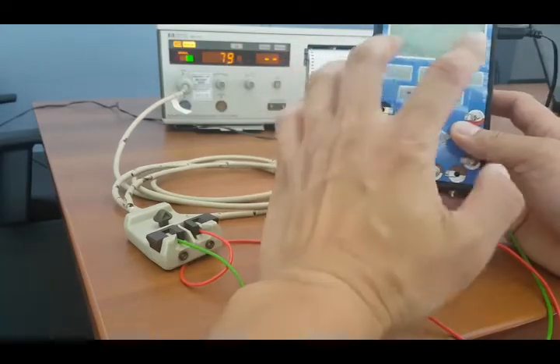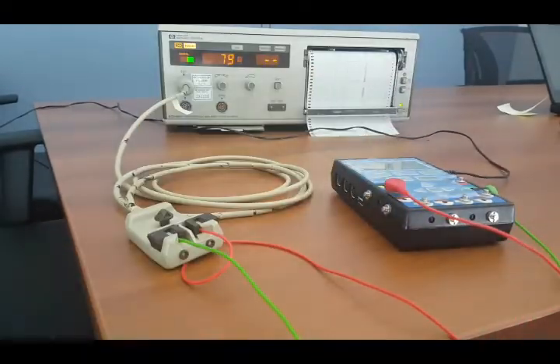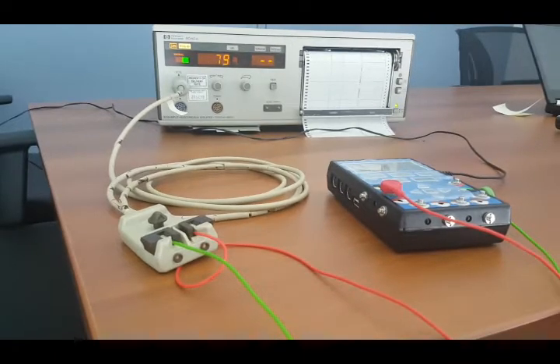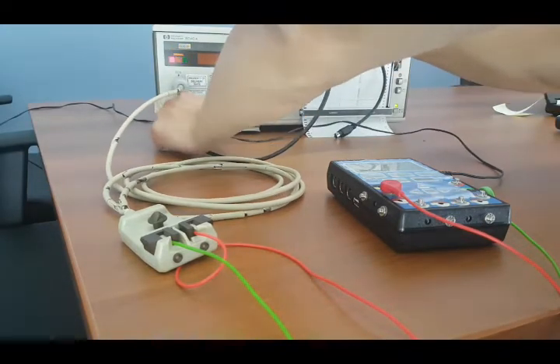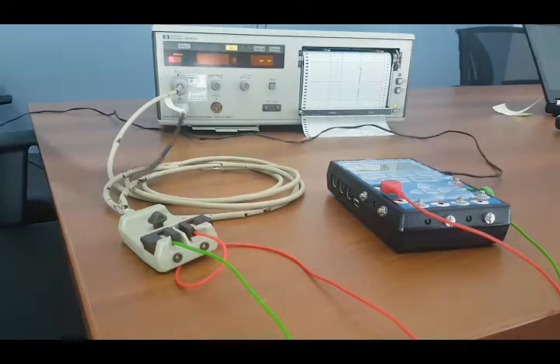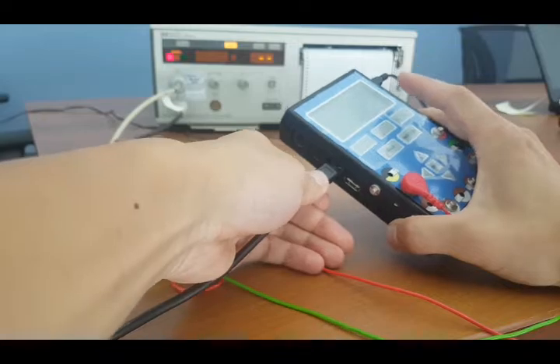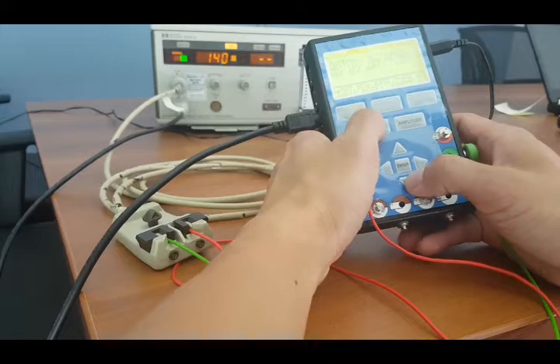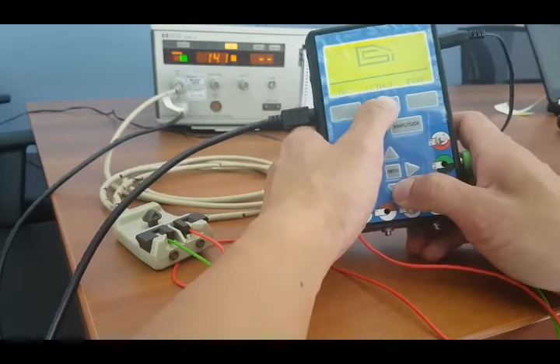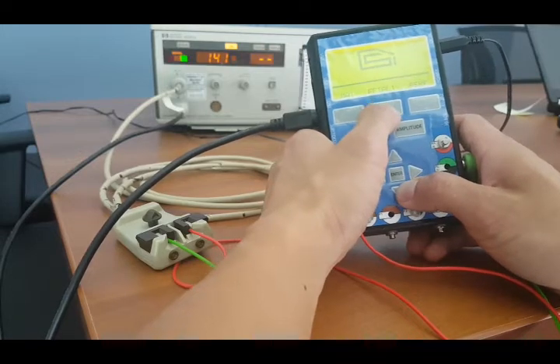So now this connects the maternal signal. Now I'm ready to connect my ultrasound cable. Connect this to the ultrasound port. The first one I will use will be ultrasound port number 1, or US1. With it connected, I'm going to go back to my main menu and go to fetal 1. So fetal 1 relates to US1 here on the output.